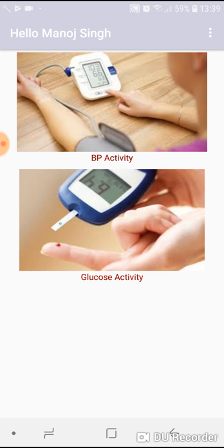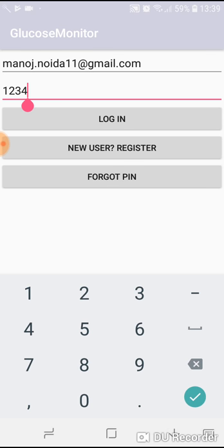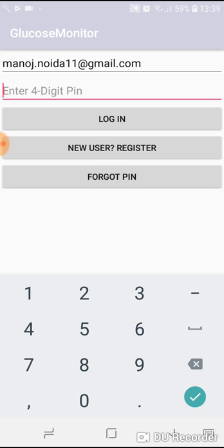Apart from that, there is the option of forgot pin. In case you forget your pin, you have to supply your email ID and press the forgot pin button. Your pin will be sent to your registered mail ID. This is how this application works.